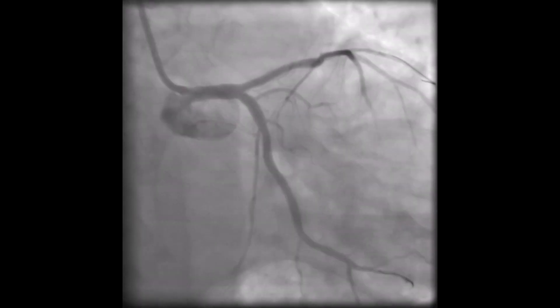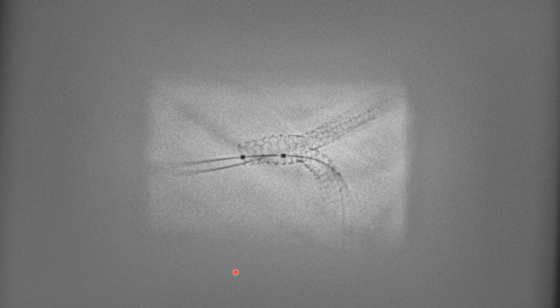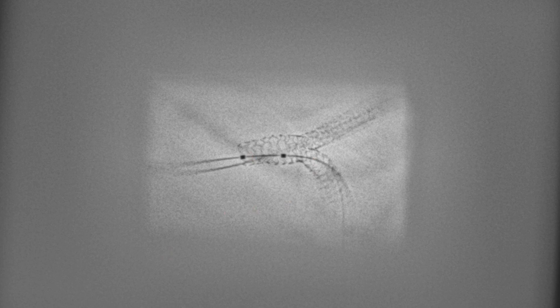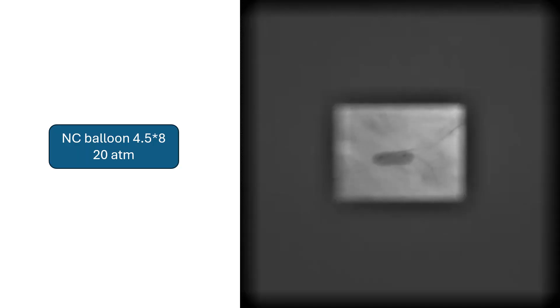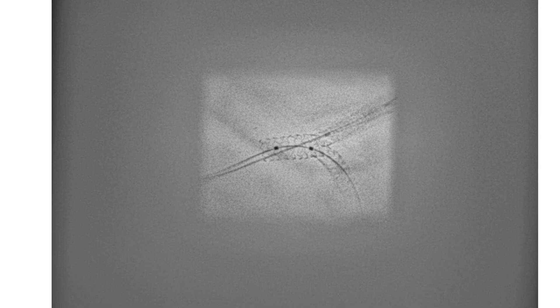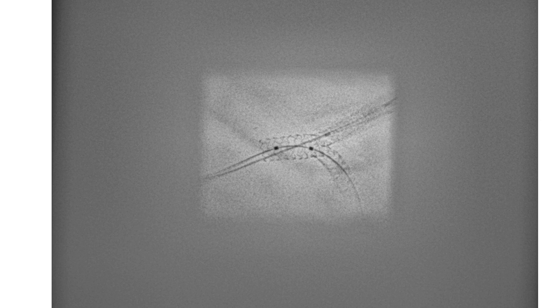This is the result. The left main stent needs a diameter more than 4 mm, so post-dilation was needed. We took a 4.5 mm balloon. Stent enhancement was done — it's very important to localize the balloon inside the stent and avoid post-dilation proximal to the stent, meaning in a healthy area not covered by stent. A 4.5 by 8 mm balloon was inflated to 20 atmospheres. Further inflation was needed at the carina, and stent enhancement was useful to position the balloon just before the carina to avoid damaging it. Another POT was done, and this is the final result.